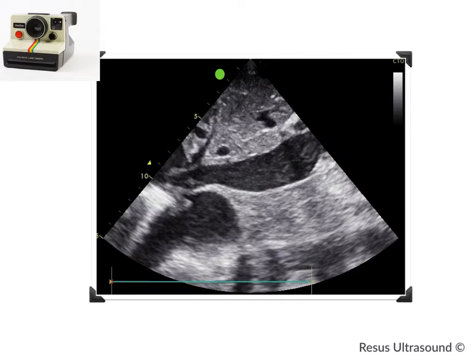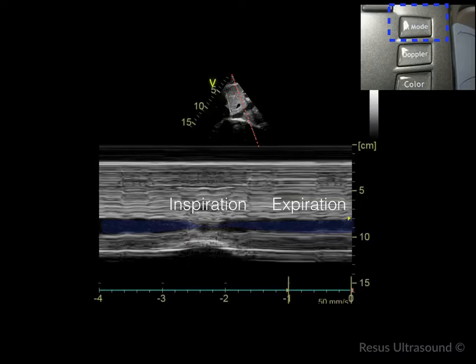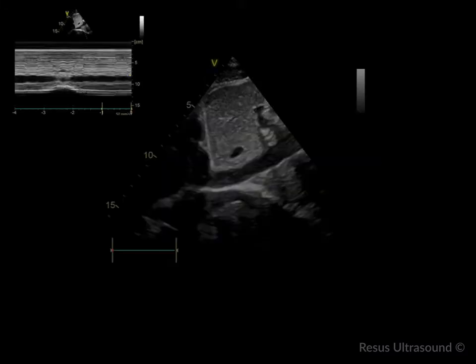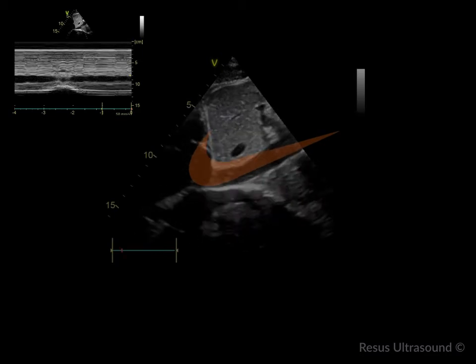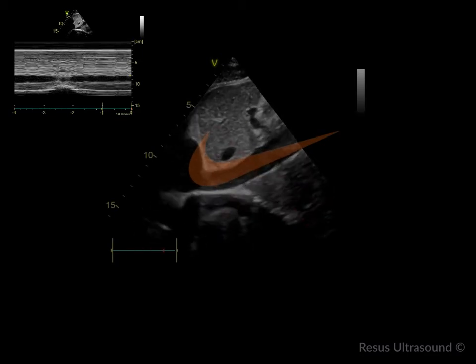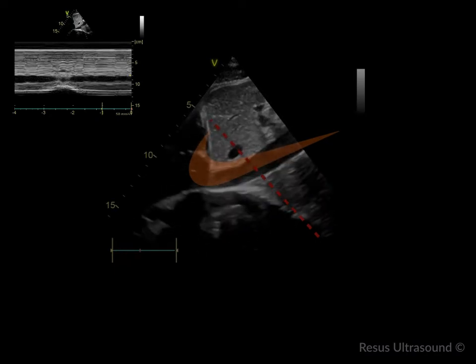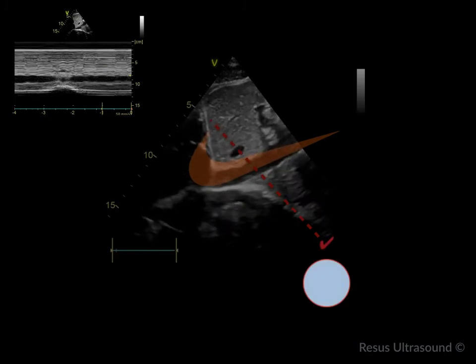To capture an image of the IVC to document whether it is large or small, use the M-mode function. When you push this button, it captures the IVC in two phases — inspiration and expiration — over time. In the image, the blue tube depicts the tube varying in diameter between inspiration and expiration. To do M-mode, imagine the IVC is a tube draining up to the RA, and place the M-mode line perpendicular to where the tube appears as a straight line.